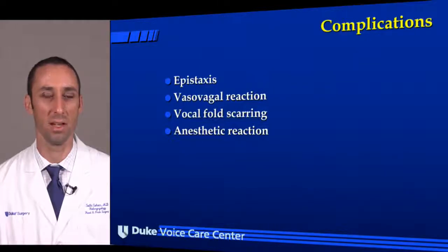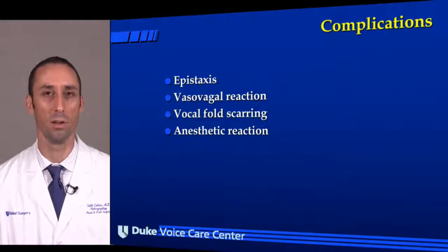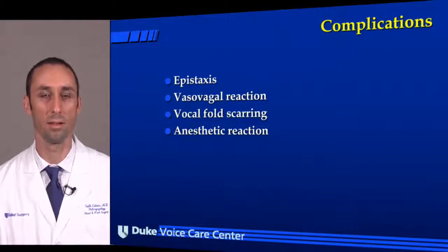Complications that can occur: epistaxis, I have not had that happen. A vasovagal reaction, I have had that happen after the procedure. You treat it symptomatically. Vocal fold scarring is the most important complication that you have to worry about. So I go through the same consent that I do for my operative microlaryngoscopic excisions to make sure that the patient understands the risk to their voice.